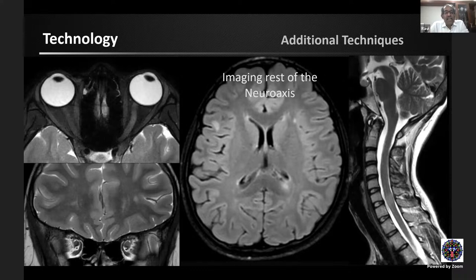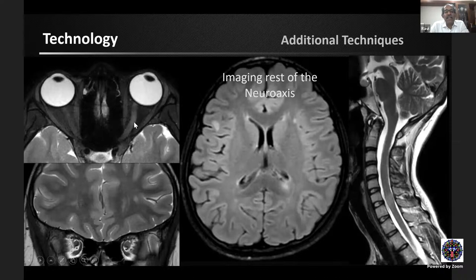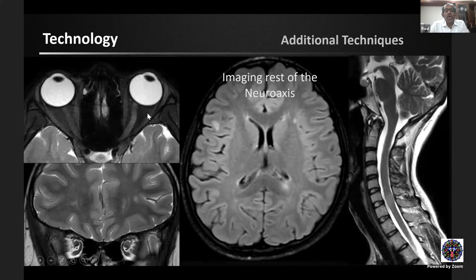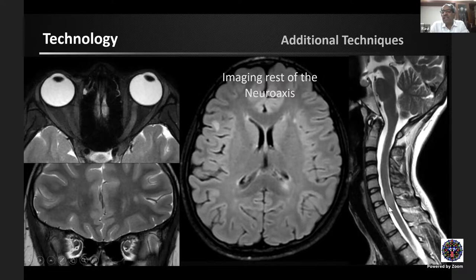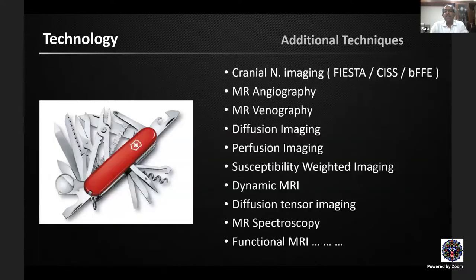Beyond the orbit, do not forget the brain. In a patient thought to have isolated left optic neuritis with bright T2 fat-saturated signal in the optic nerve, orbital sequences also captured a small white matter plaque. Protocol dictates we screen the whole brain and spinal cord for suspected optic neuritis — finding multiple juxtacortical, periventricular, and short spinal cord lesions confirms multiple sclerosis. Patient management changes significantly when the study is extended to include the brain.